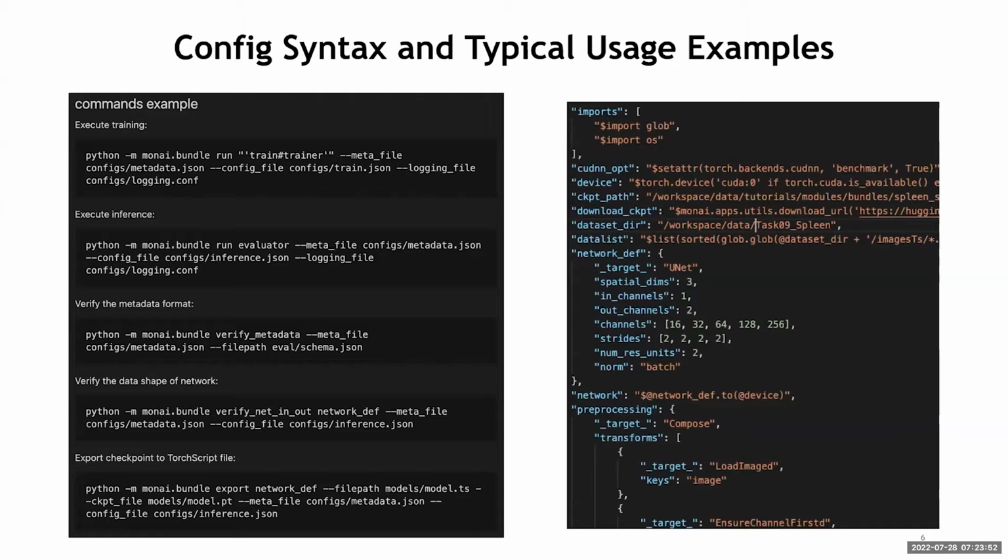But in general, the idea to get from this is what the JSON looks like. We have a number of keys that are going to be defined in terms of textual values or in terms of Python code values or in terms of object references. And then these can be amalgamated together into a single workflow concept. And we'll see how to invoke that later.